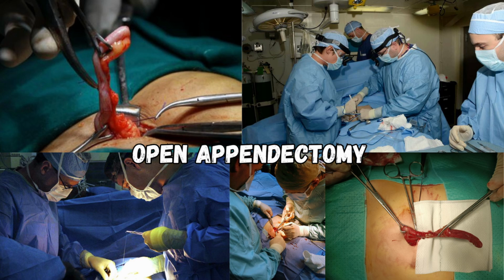Step 2. Skin incision. A small oblique incision is made over McBurney's point, using a number 10 blade. Skin and subcutaneous tissues are divided with the scalpel and extended as needed, using Metzenbaum scissors for deeper tissue. Make sure to incise through Camper's and Scarpa's fascia separately to maintain anatomical planes and reduce postoperative seroma.